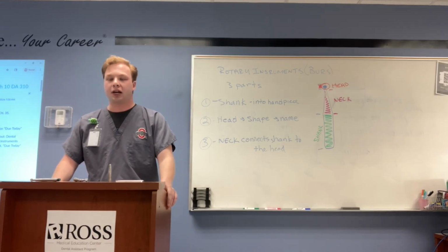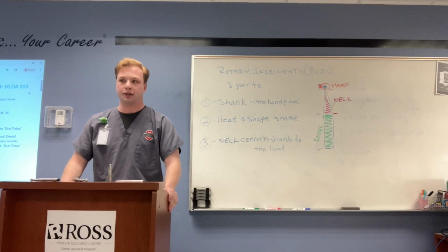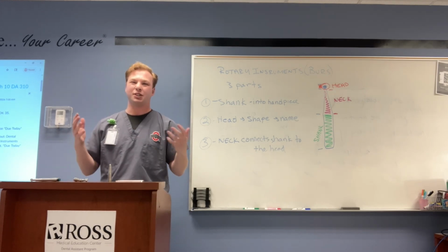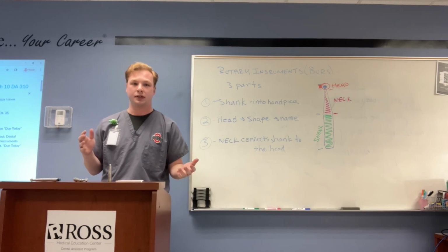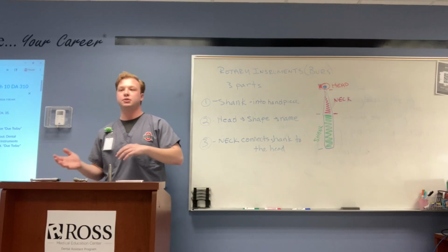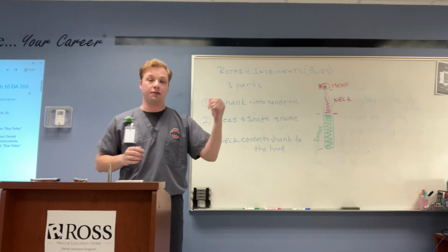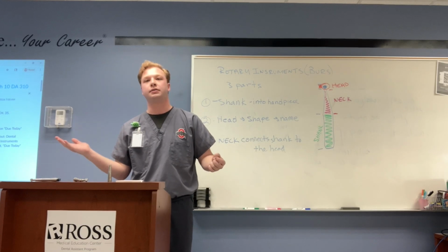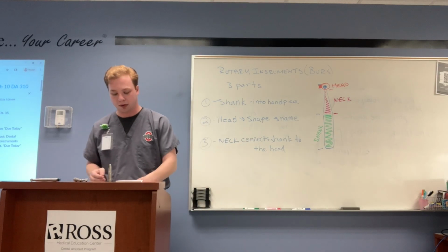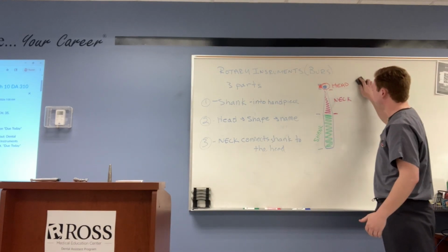Dentists use them often for crown preparations, but at Children's, where money was a little tighter, we used carbide burs, which work just the same. I actually like carbide burs a lot better than diamond burs. I like the way they cut, but it depends on the doctors. A lot of the doctors at Children's, we were trained on carbide, but when you go into private practice, if you can afford them, they'll probably use a diamond bur. So let's write up diamond bur, and then we ought to talk about what that is.